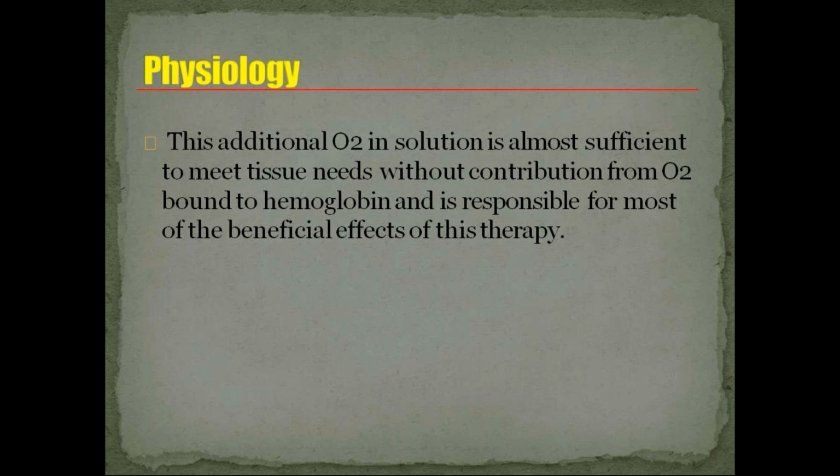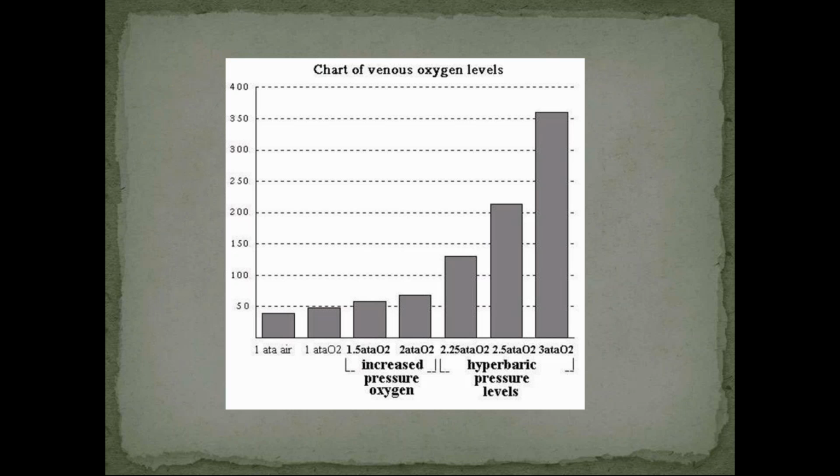This additional oxygen in solution is almost sufficient to meet the tissue needs without contribution from oxygen bound to hemoglobin, and is responsible for most of the beneficial effects of this therapy. You can see here, at hyperbaric pressure levels, the venous oxygen levels are very much higher.